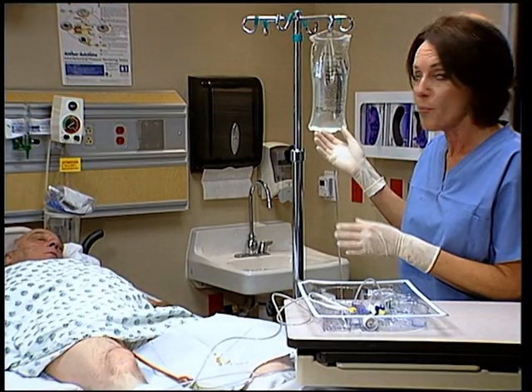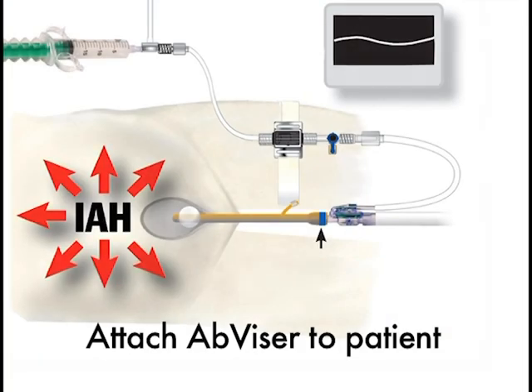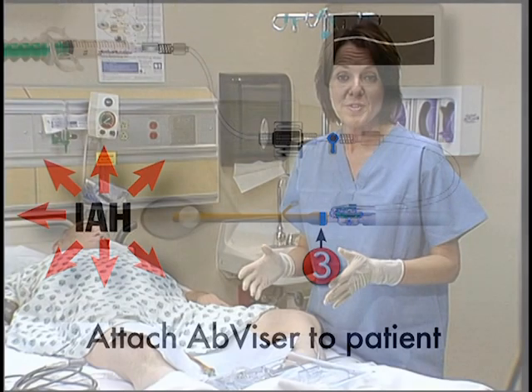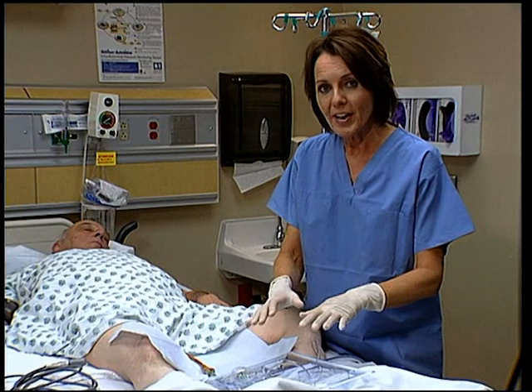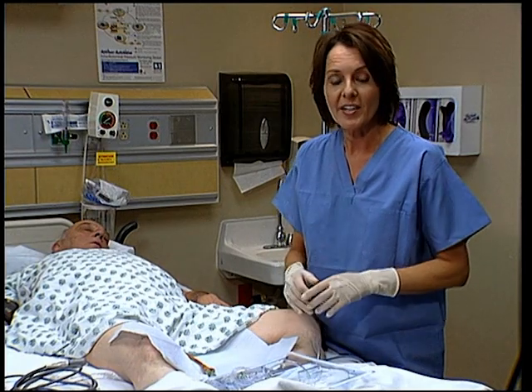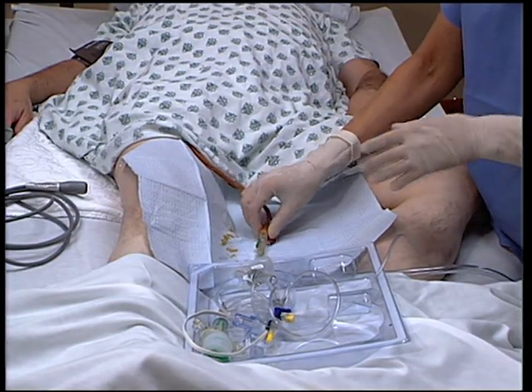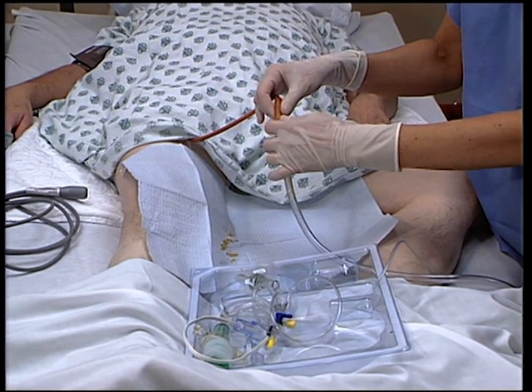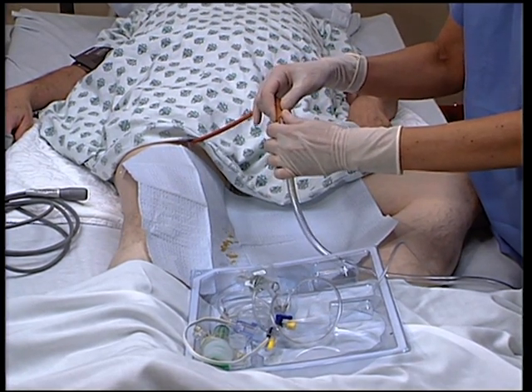Note that no pressure bag is required for intra-abdominal pressure monitoring. It's now time to attach the AbVisor to the patient. Put the AbVisor tray with all the contents onto the bed between the patient's legs. Disconnect the Foley from the drain bag and hold both exposed tubes upright to prevent urine from leaking onto the bed.